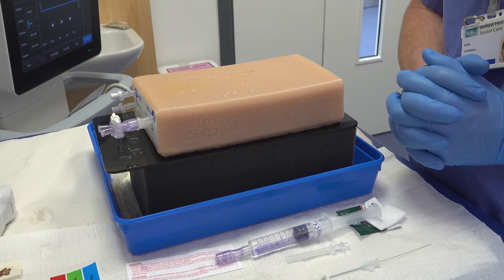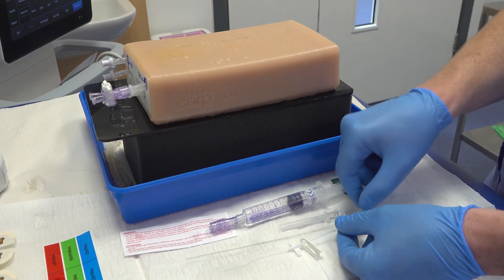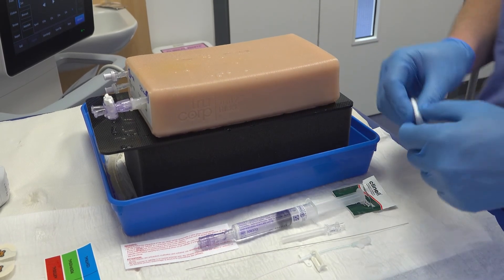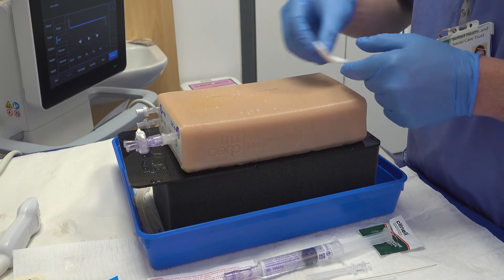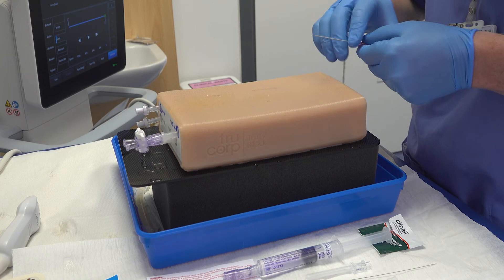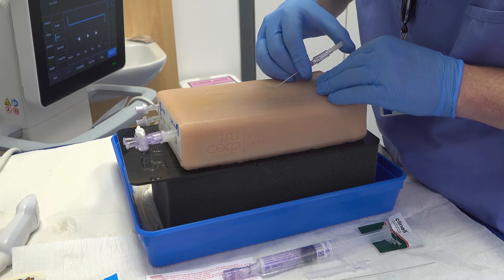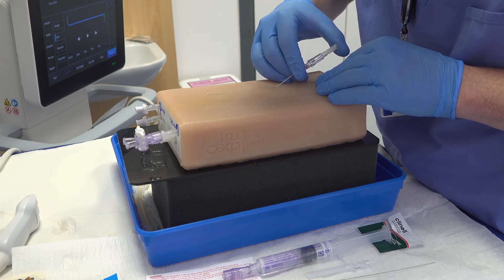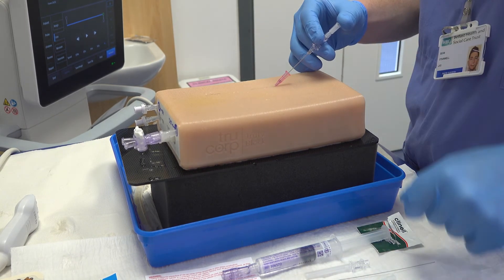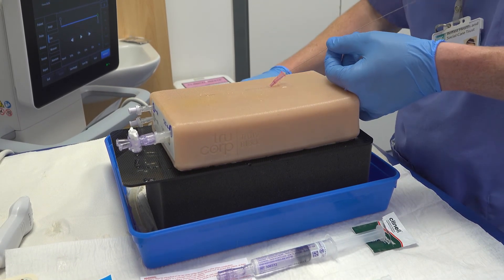I will now show you how I enter the vessel, use the Seldinger technique and secure the line. I have opened my midline, separated the guide wire and flushed the line. I will have prepared the patient, parent and equipment and selected a good vein in advance. I make sure the skin has had adequate topical anaesthetic and has been cleaned. Here I am entering the vessel using a cannula. I remove my needle and place it in a sharps bin. The cannula should bleed back freely — this is the best time to take bloods if they are required.